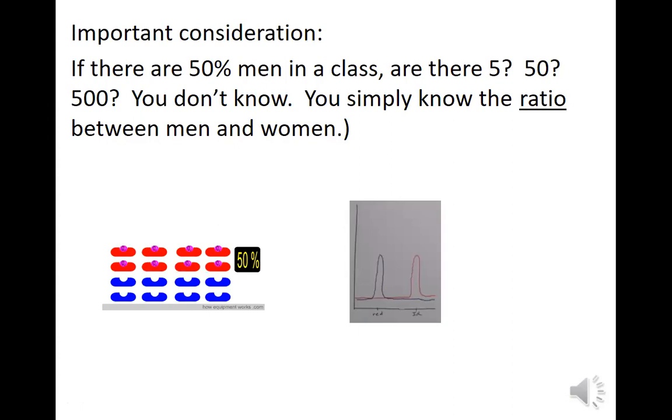That's the other reason why the SpO2 pulse oximeter has its drawbacks. Because if you have a low amount of hemoglobin, but what hemoglobin you have is highly saturated, it's going to give you a good reading, but you still could be in respiratory distress, which you'll see. So this is the 50-50, makes sense, just so you understand the percentage.